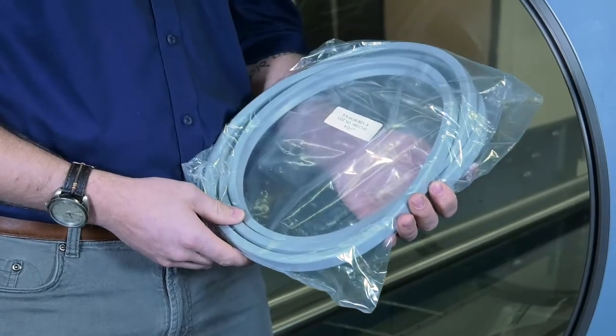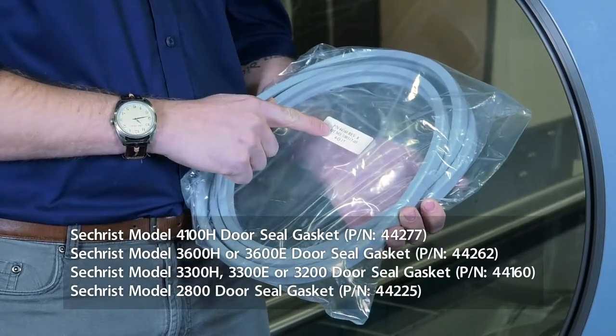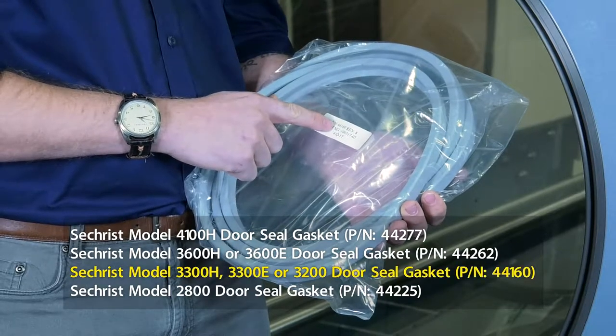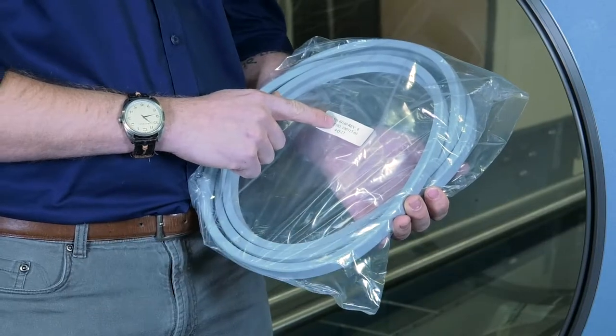Your door seal is going to arrive in a package just like this. As soon as you get it, you want to check the part number. Make sure this is the correct part number for your chamber. This part number is for a door seal for a 33H chamber, but depending upon what model chamber you have, you may have a different part number.